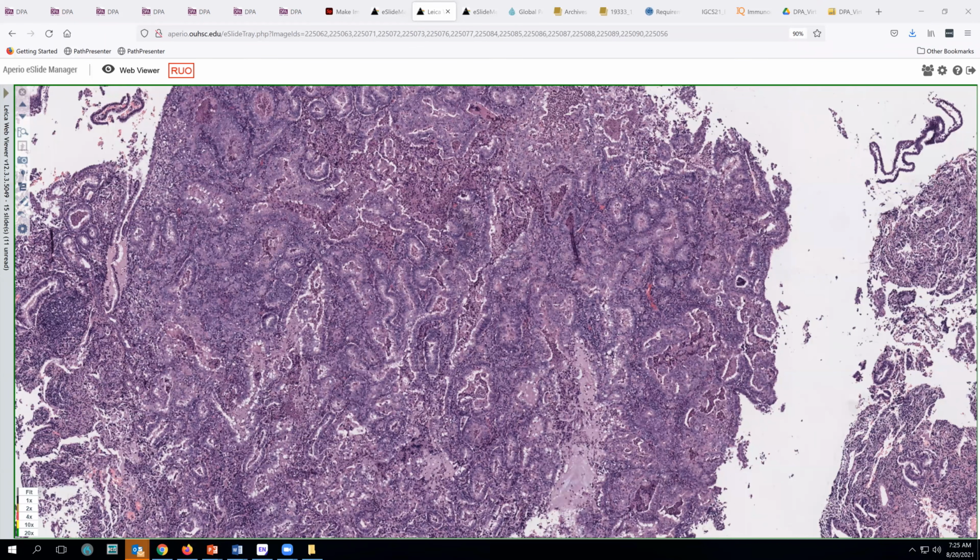The other feature that we do, and which I think is much more widely practiced than a p53 stain, of course, is mismatch repair protein evaluation. So we use a 4 antibody panel, which includes MLH1 and PMS2, as well as MSH6 and MSH2.